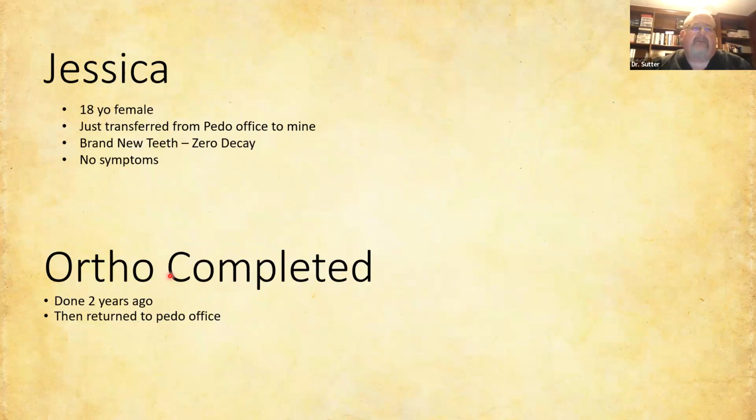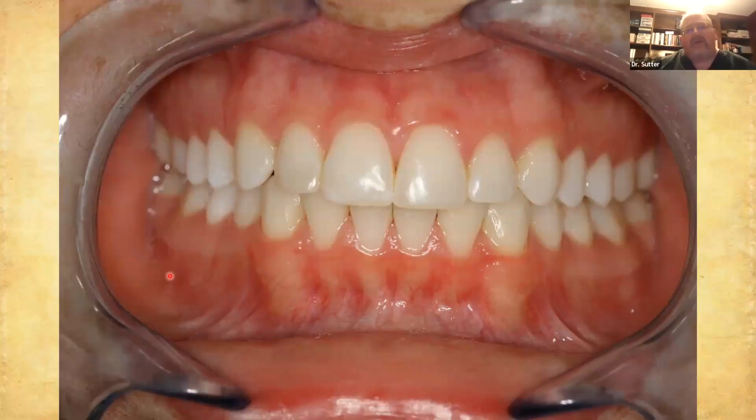So the bite has had plenty of time to settle in and create whatever home base the rebound of the ortho occlusion is going to create, right? They say 6 months, it's been 2 years, and she admits, I don't wear my retainer. It's been a while. So here you go. I'm looking at this, and for my eye, looks like the midlines are on pretty good. I don't have any concern there.